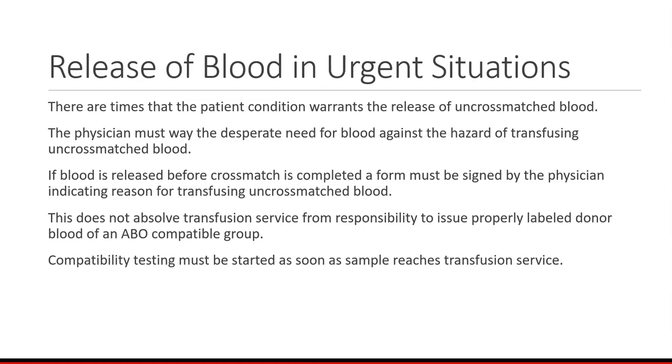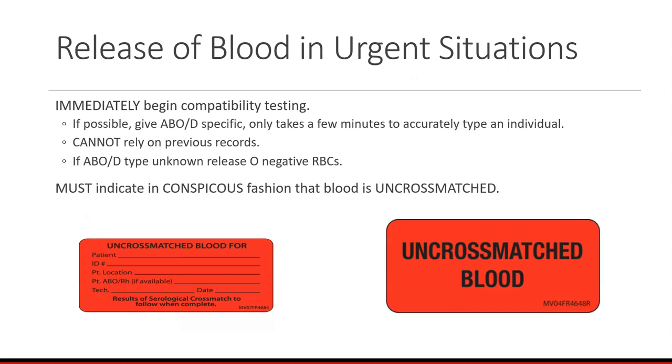Compatibility testing must be started as soon as the sample reaches the transfusion service. And at my institution, we trade. Here's your uncross-matched blood, and they hand me the tube of blood for the cross-match. Because once they start transfusing that blood into the patient, we now have however many donor units are in there plus the patient, and that can muddy the waters when it comes to compatibility testing.